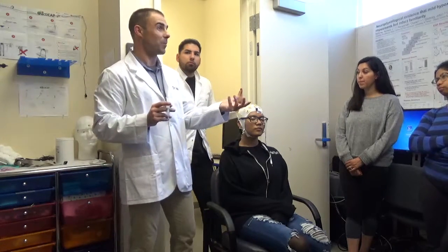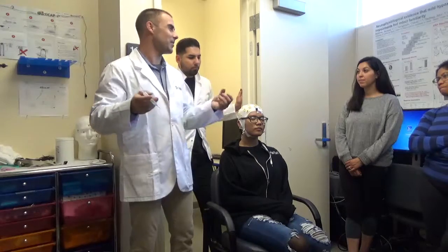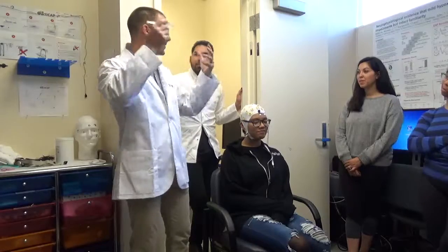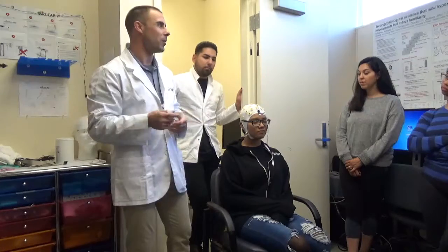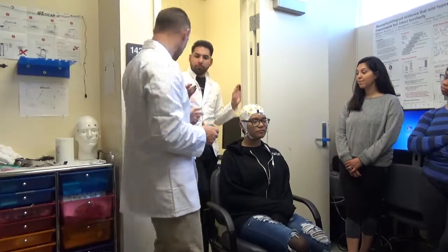Now, what's kind of funny is, I told the story of one of my best buddies who did this and almost freaked out because he got a little alcohol swab on a cut in his face. Usually, the guys tend to be really sensitive to this. And usually the girls are like, yeah, I go to the beauty salon all the time. I know. Pull my hair all the time. Girls are used to people futzing around up there, and they're a little bit not as sensitive. So do be mindful of that, because sometimes the guys actually won't say anything, and you want them to let you know. As well as the girls too. So have some fun.